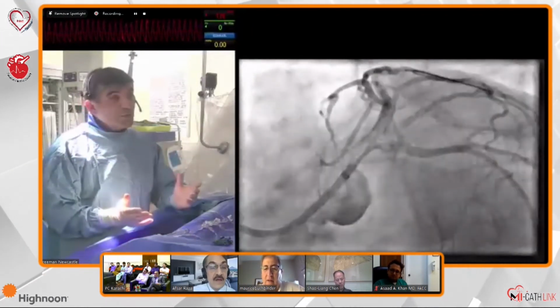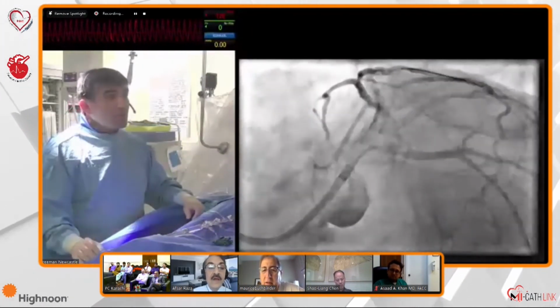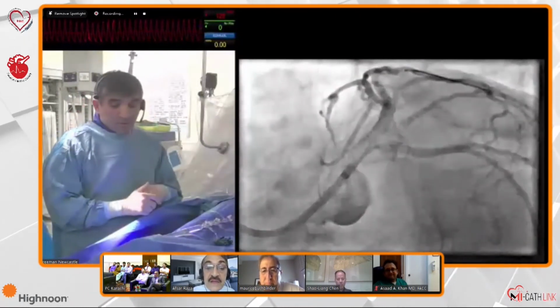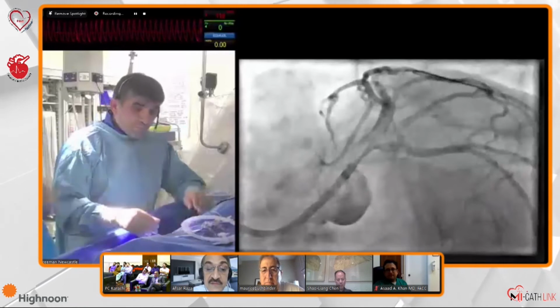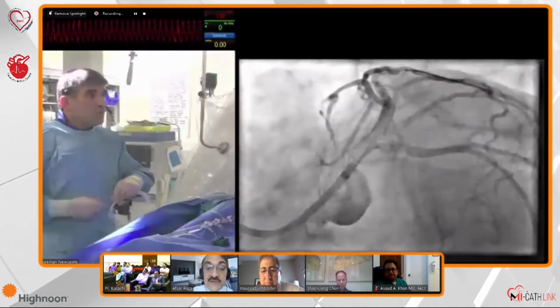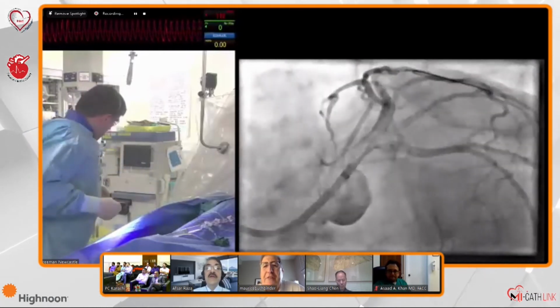In fact, you do not need to kiss because you haven't crossed into the LAD. I'll just do a final. Yes, I think in this patient, leaving the circumflex alone is not safe. I think it will definitely come back. So it has to be stented, absolutely. Everything will come back.